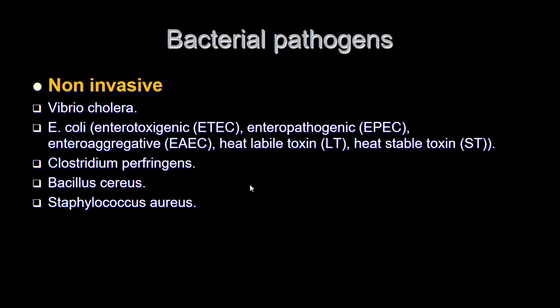So it is extremely important then, after knowing this type of a diarrhea, whether it is an invasive or a non-invasive type of a diarrhea, to know the infectious agents that are associated with diarrhea. Very, very important to know. And then how to collect the specimen, and then what are the media that you need to use, and the culture, and then identification, and to make the diagnosis.